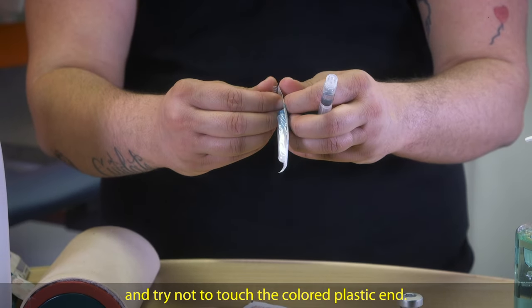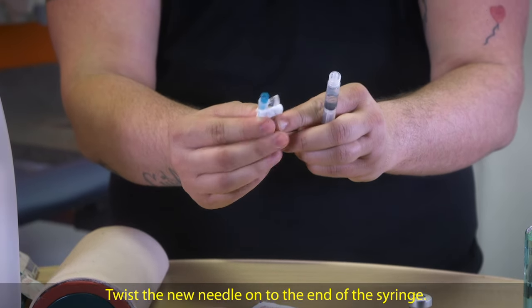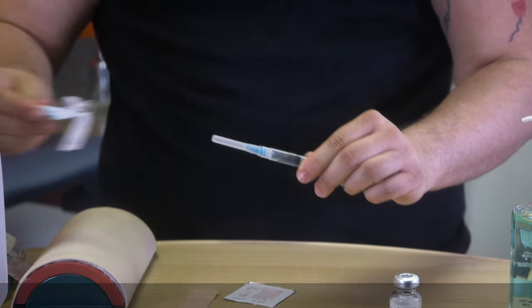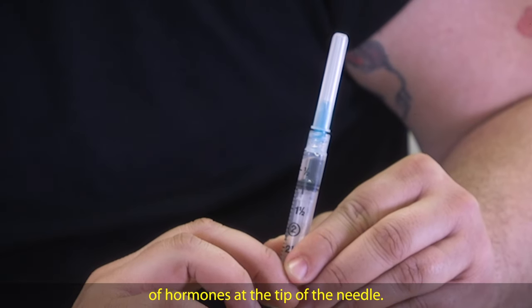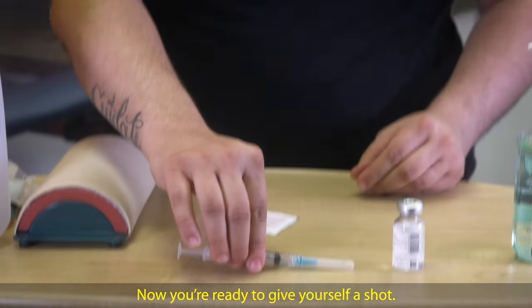Open the extra needle and try not to touch the colored plastic end. Twist the new needle onto the end of the syringe. Push on the plunger until you start to see a bead of hormones at the tip of the needle. Now you're ready to give yourself a shot.